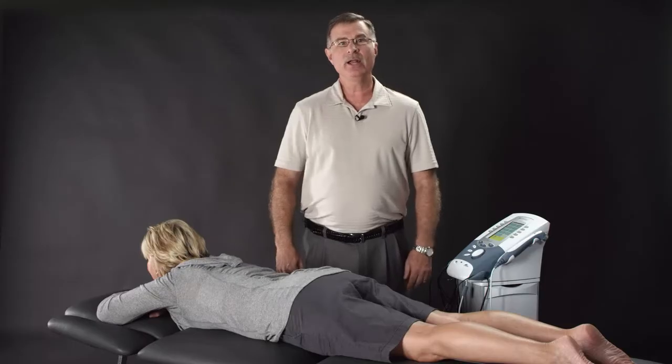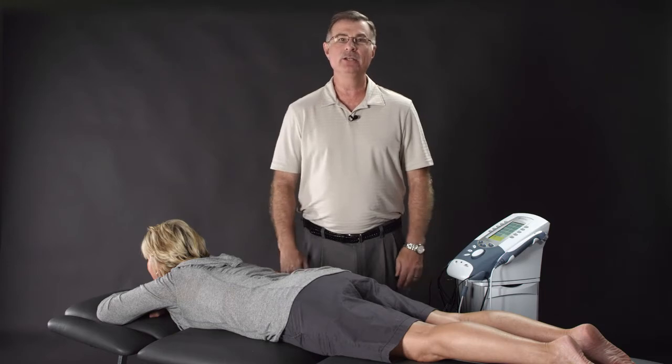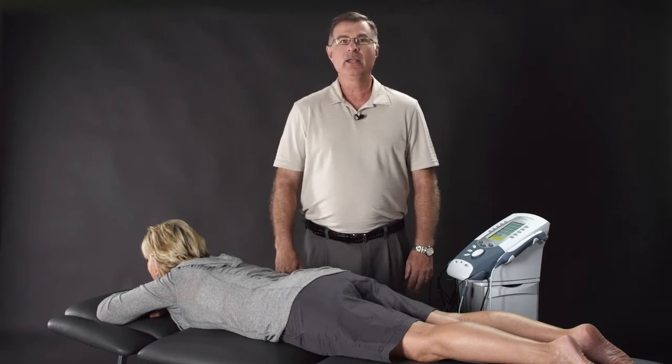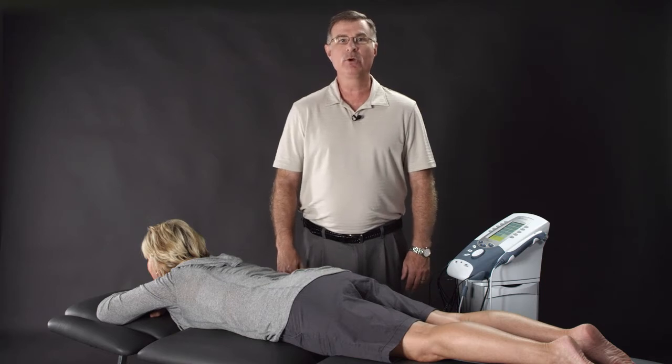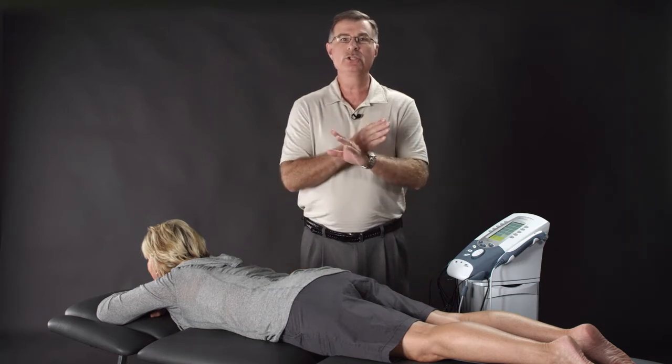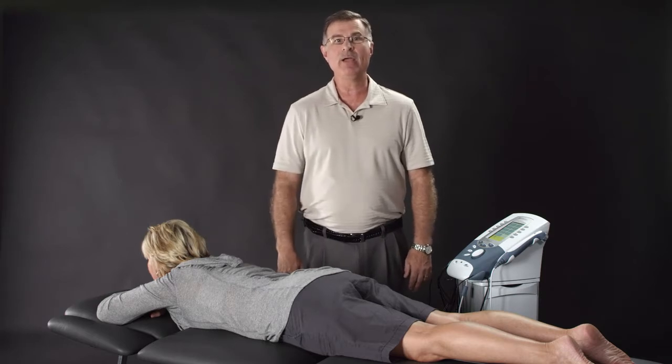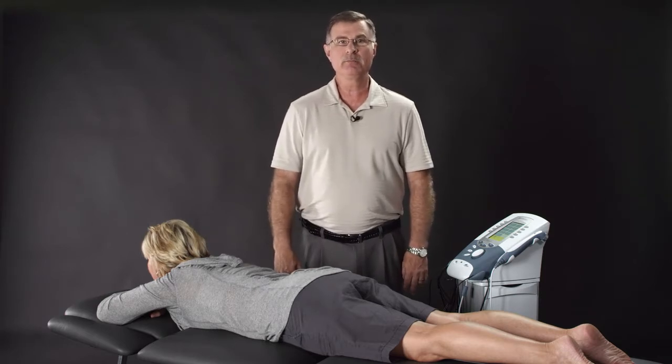Today I'm going to show you how to use interferential and pre-modulated to treat acute and chronic pain. Interferential current is a two-channel middle frequency unit, and when we cross the two currents, we get an interferential or an interference wave at the point or at the treatment site.